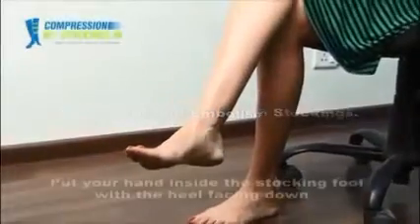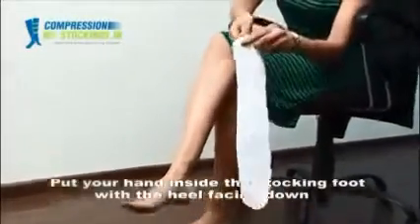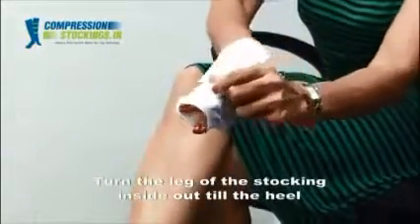Donning of anti-embolism stockings. Put your hand inside the stocking foot with the heel facing down. Turn the leg of the stocking inside out till the heel.